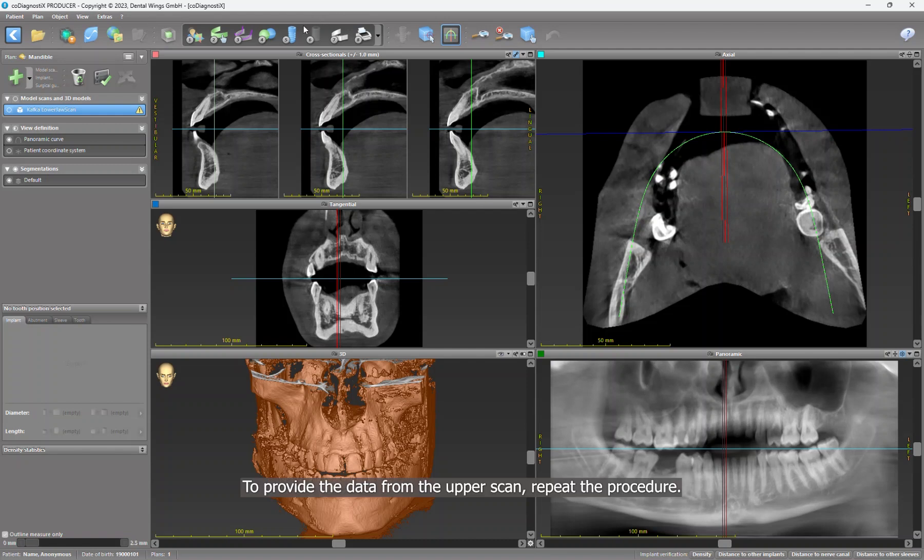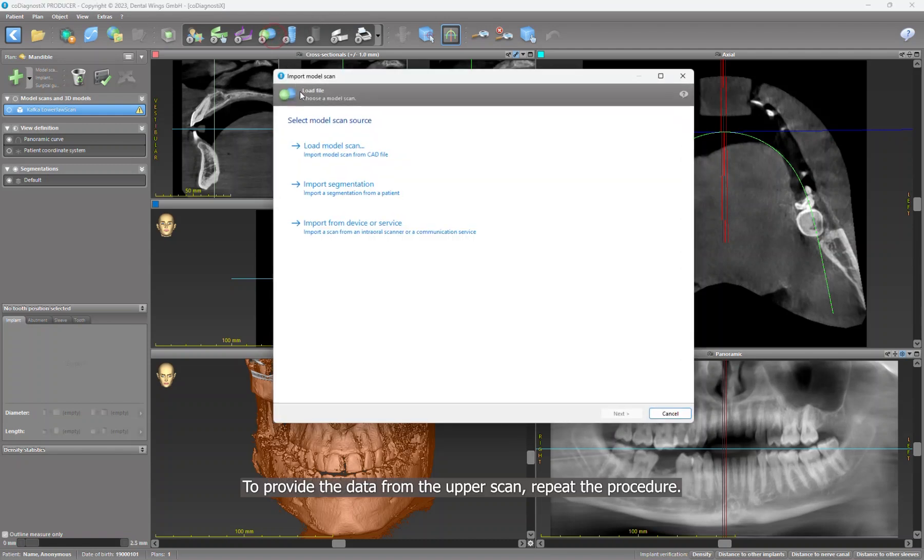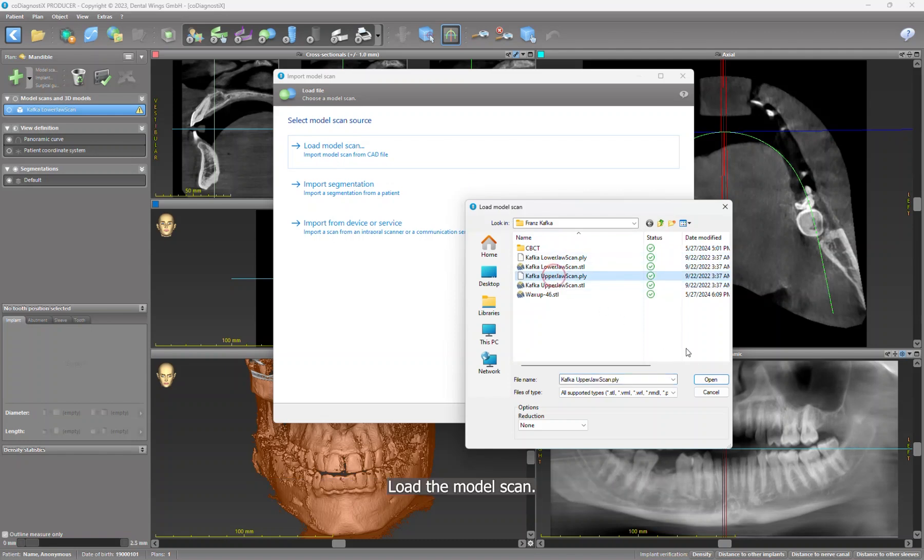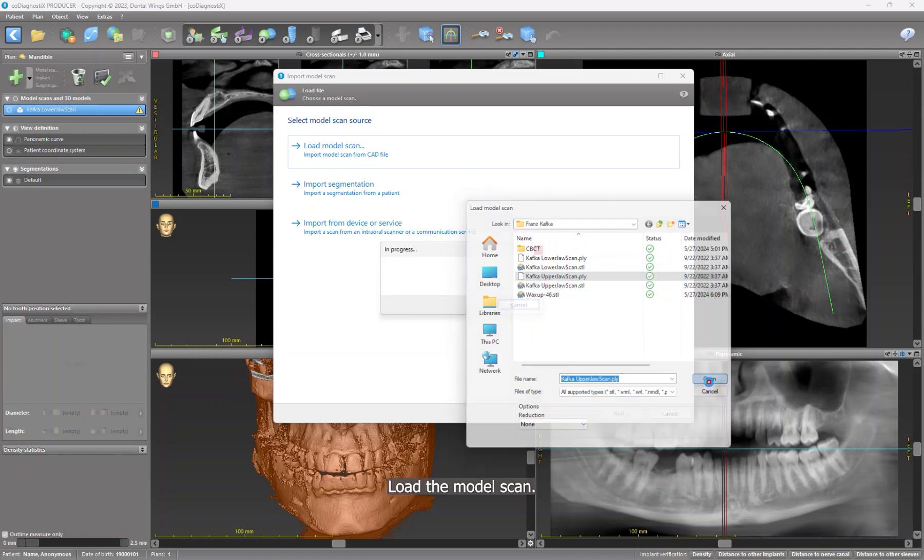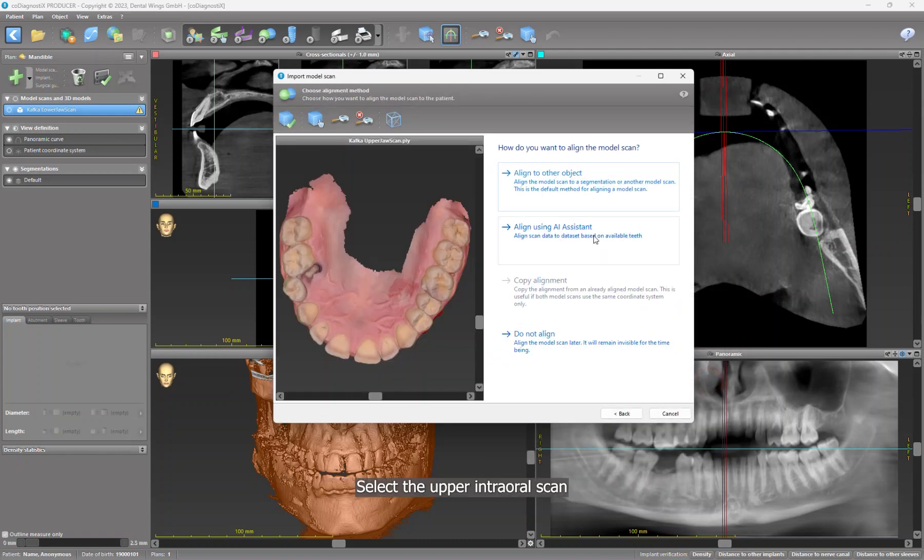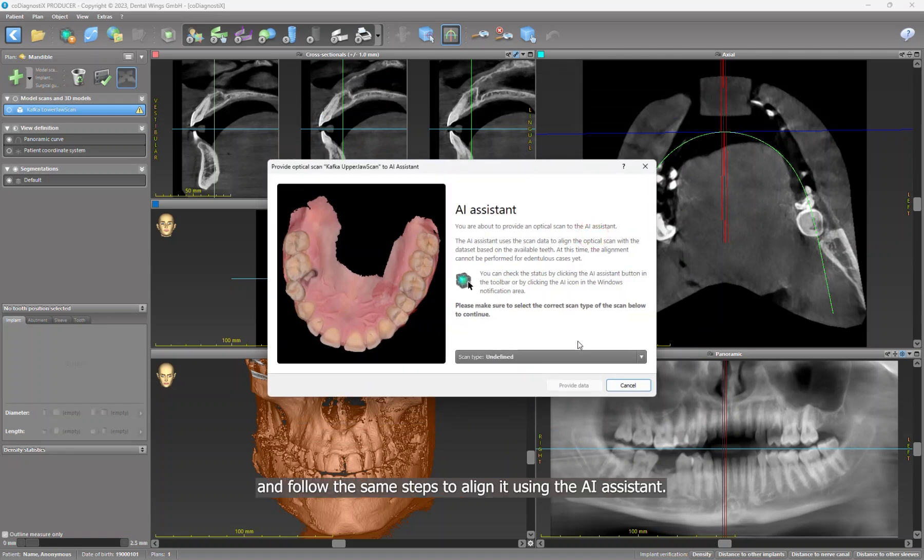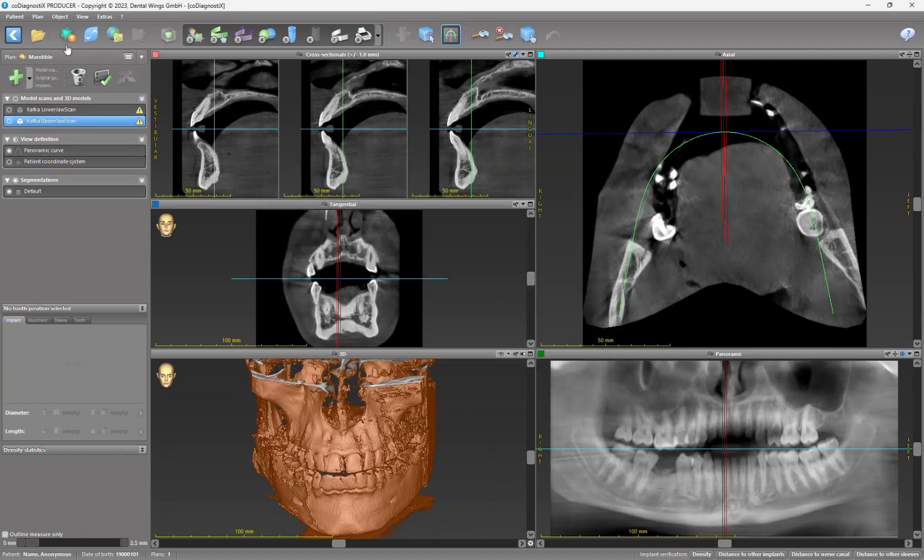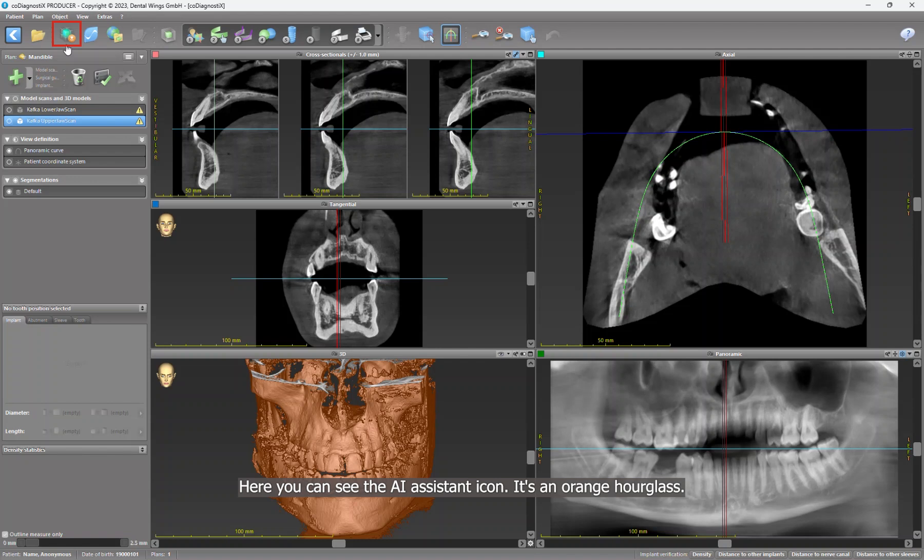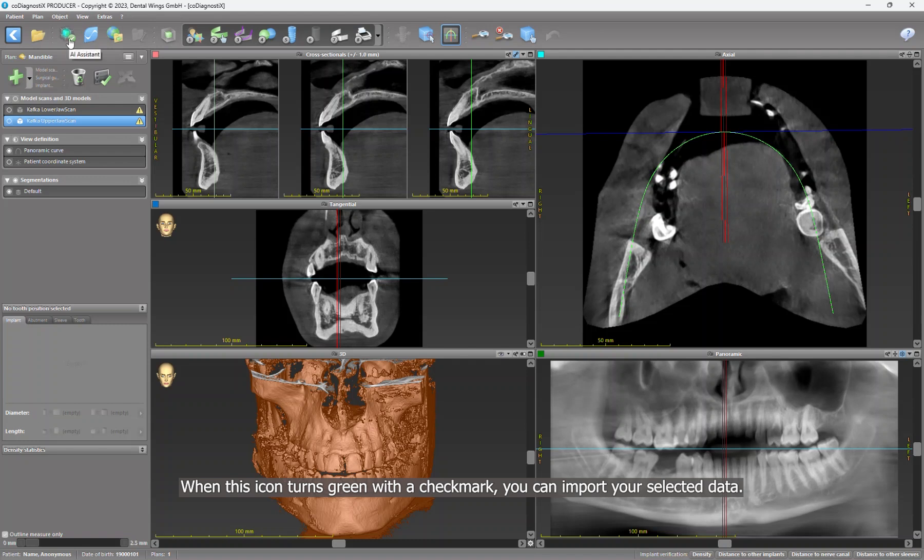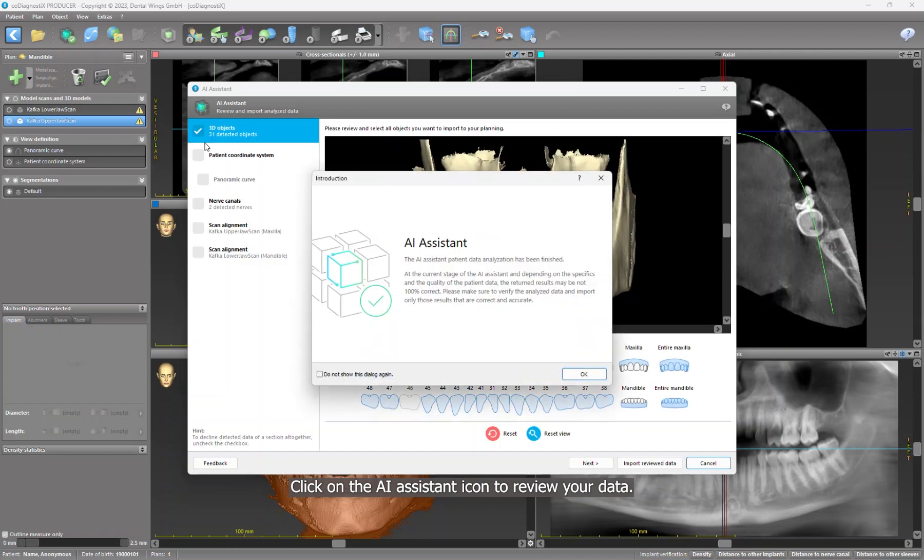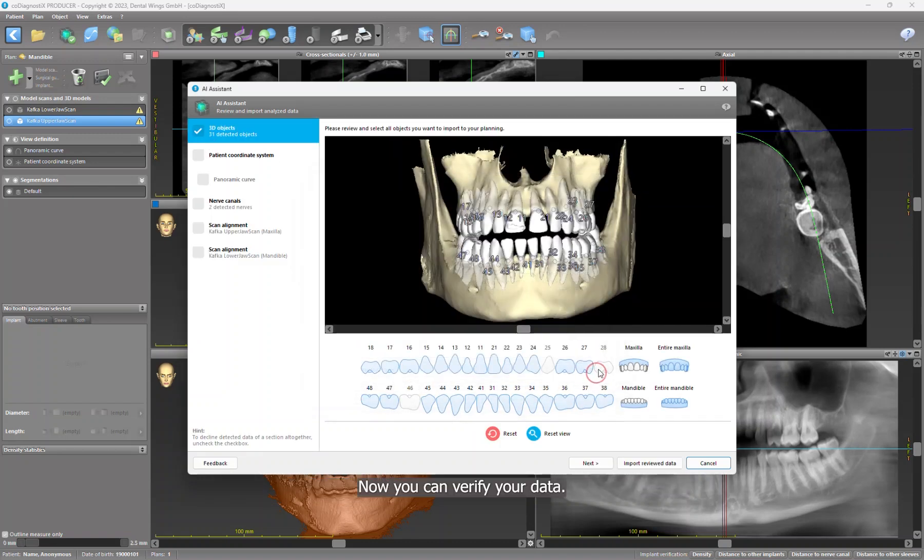To provide the data from the upper scan, repeat the procedure. Load the model scan, select the upper intraoral scan, then follow the same steps to align it using the AI assistant. Here you can see the AI assistant icon. It's an orange hourglass. When this icon turns green with a checkmark, you can import your selected data.